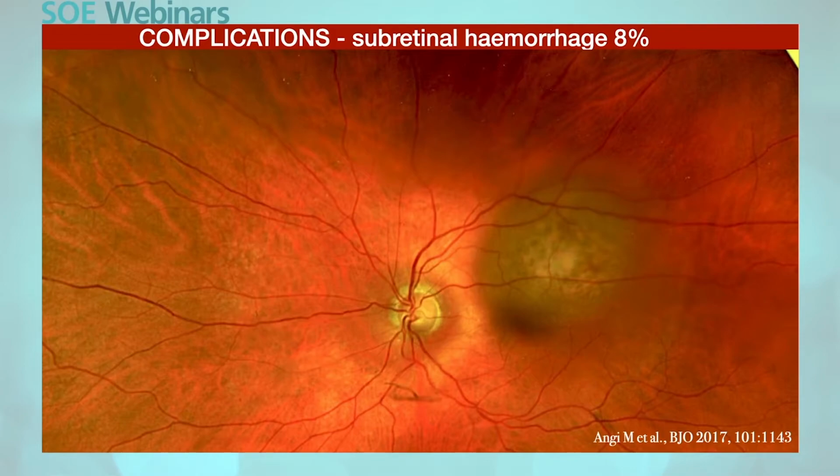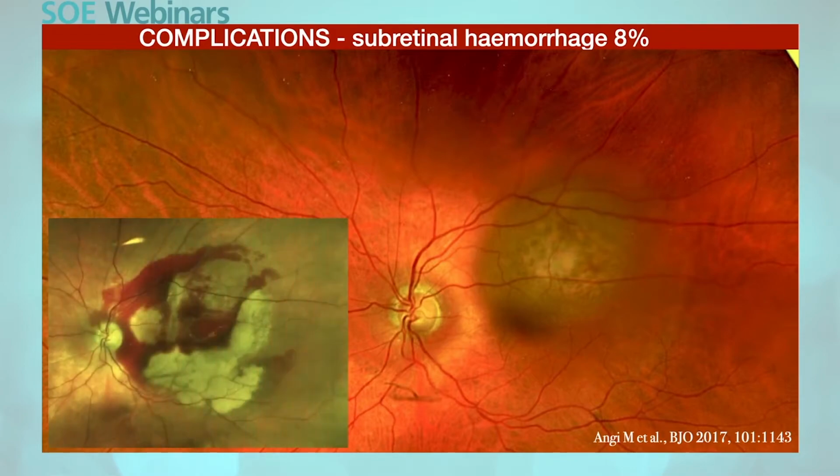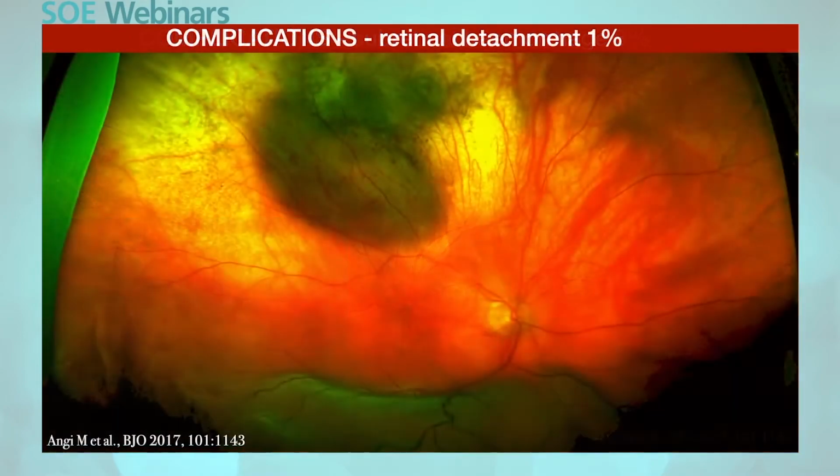There was a little bit of bleeding during the biopsy, but unfortunately it bled afterwards, a week later, with a submacular hemorrhage. So you need to understand that this is a procedure that can cause severe problems, in particular in tumors close to the fovea.